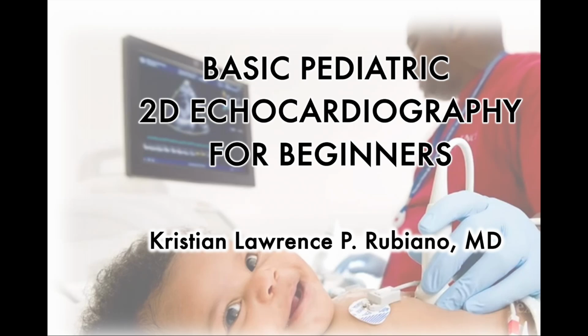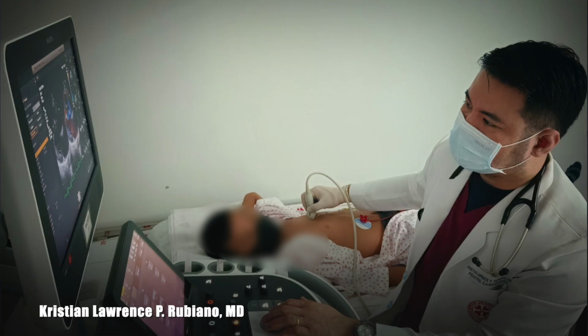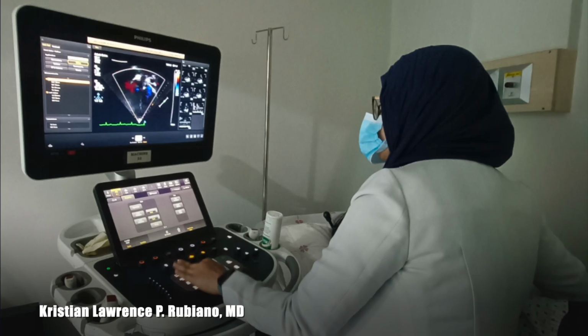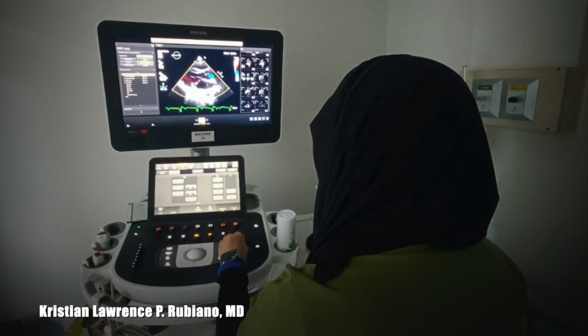Good day, everyone. I am Dr. Kristian Rubiano, and today I have prepared a basic instructional video on basic pediatric 2D echocardiogram. As mentioned, this video will only cover basic what to do's in doing 2D echocardiogram, including how to do different echo views and how to measure structures and Doppler signals.